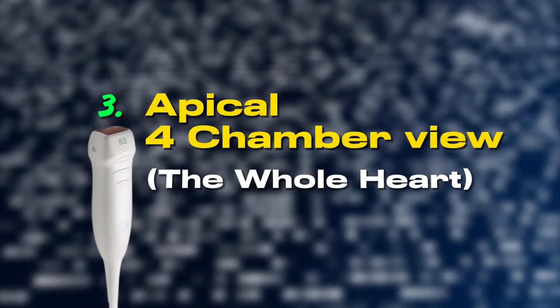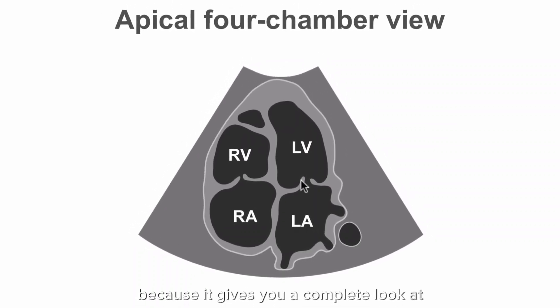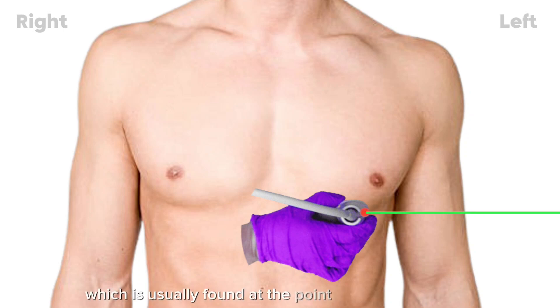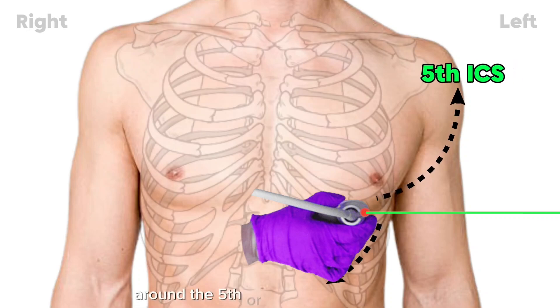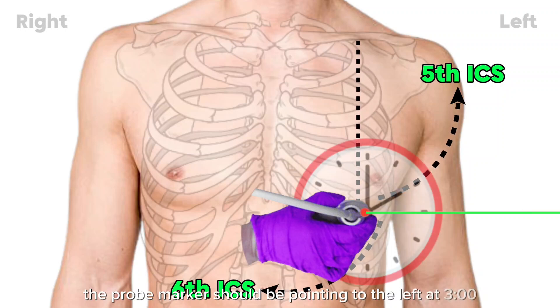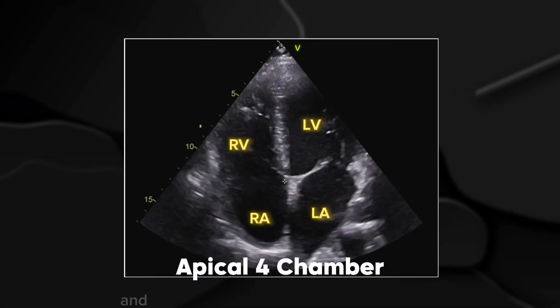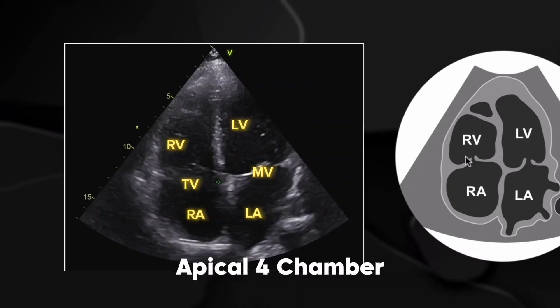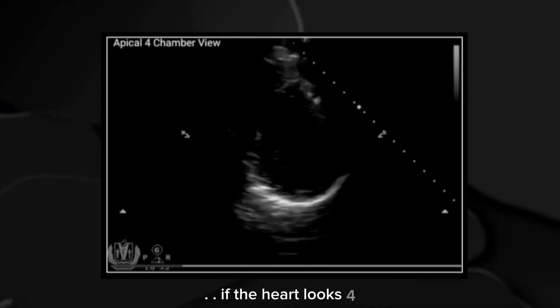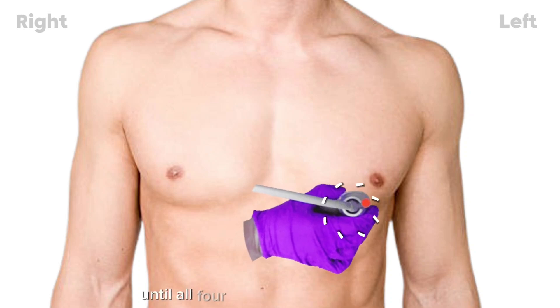Apical four-chamber view — the whole heart in one frame. This is one of the most important views because it gives you a complete look at all four chambers of the heart. Place the probe at the cardiac apex, which is usually found at the point of maximal impulse, around the fifth or sixth intercostal space at the mid-clavicular line. The probe marker should be pointing to the left at 3 o'clock. If done correctly, you will see the left and right atria, the left and right ventricles, and the mitral and tricuspid valves in motion. Common mistake: if the heart looks foreshortened or squashed, adjust the probe by angling it slightly upwards or rotating it slightly until all four chambers are well aligned.